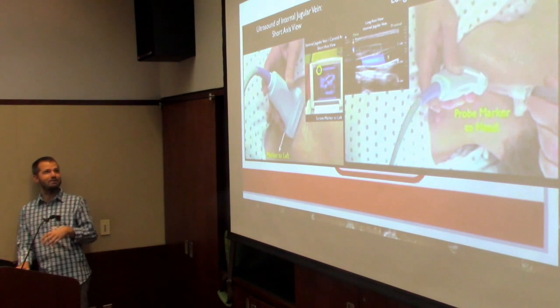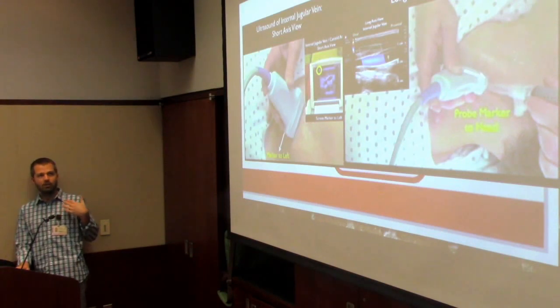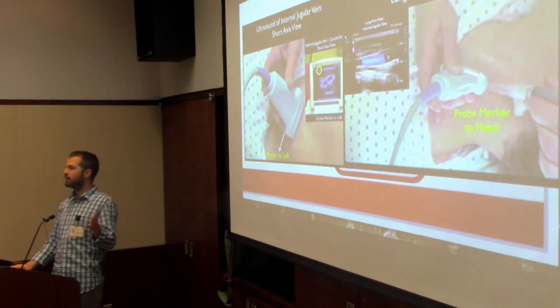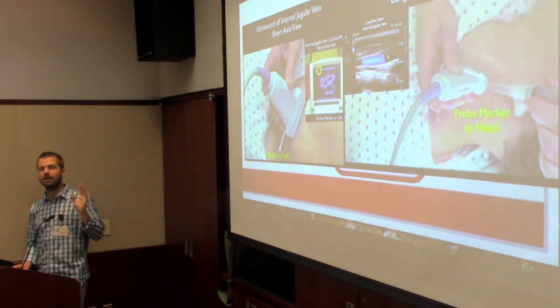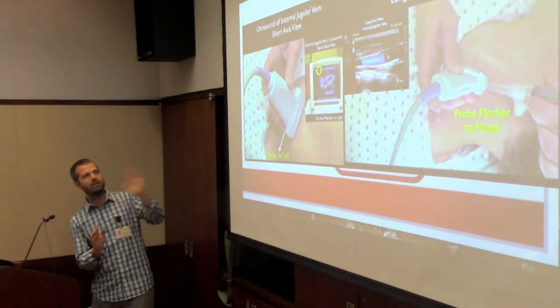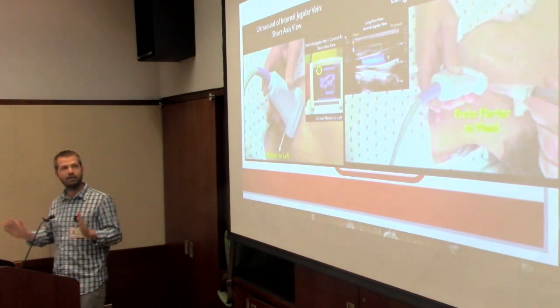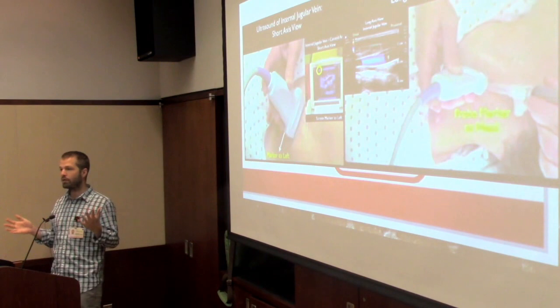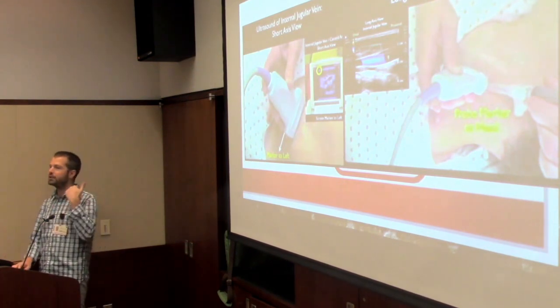Of course, Riley shows up as I pull up an ultrasound picture. Don't just look at it in one axis. For any procedure, look at it in both axes, because each of them adds information. One adds a lot of left to right information, great for depth, comparison, and what other things are in the area I might hit. If there's an artery to the left and the vein is to the right, I would rather err to the right. I'm going to enter to the right. It tells me what I'm going to go through. Is it muscle, which is going to hurt like hell? Is it fat? All these things are great in one axis. And the other axis I find very useful for the directionality.